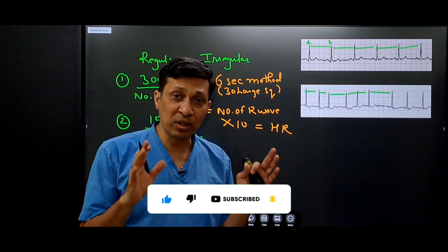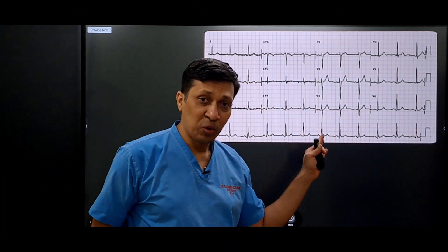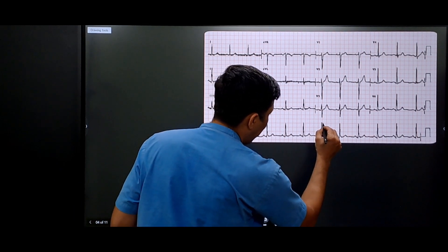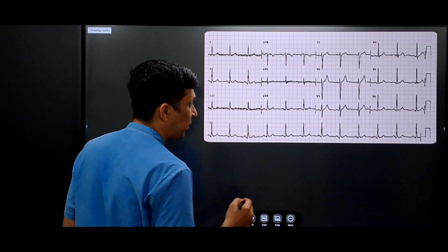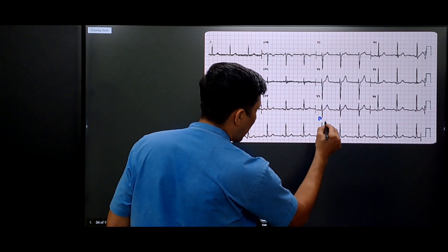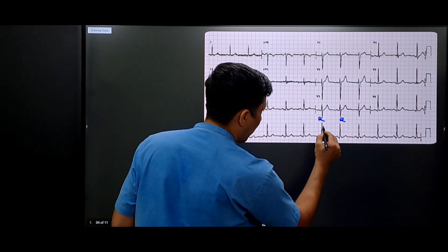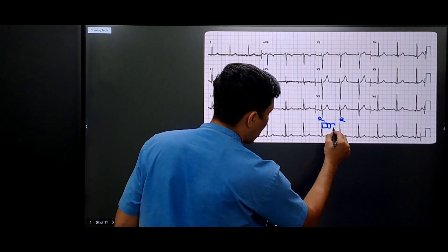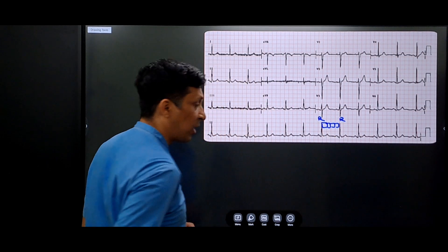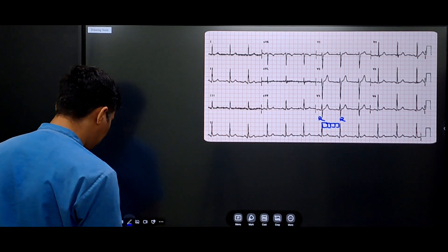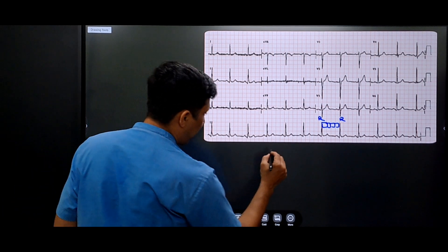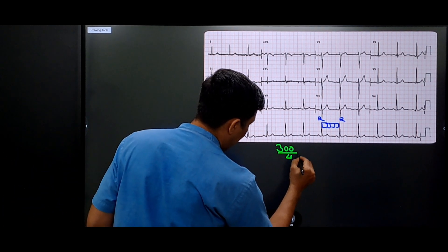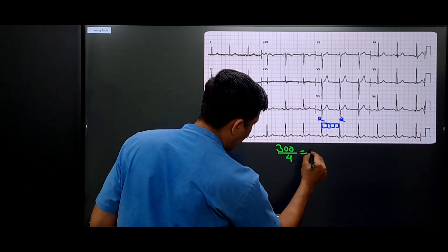Now we will see all these things on an actual ECG. In this lead, we will calculate the number of squares between two R waves. This is one R wave and this is another R wave. The number of large squares is 1, 2, 3, and 4 — so 4 large squares. According to the formula, the heart rate will be 300 divided by 4, which equals 75.